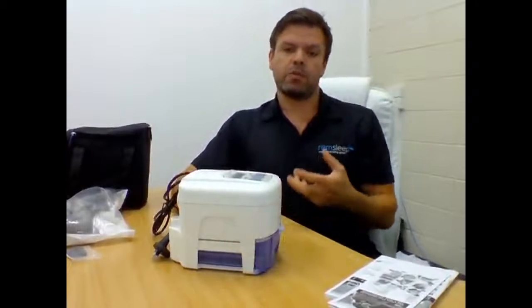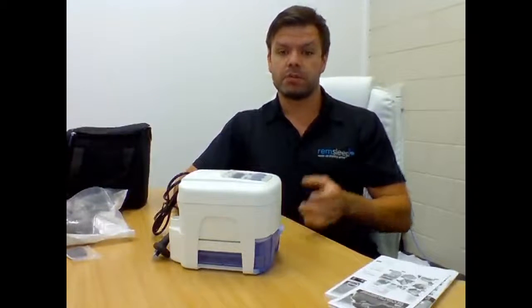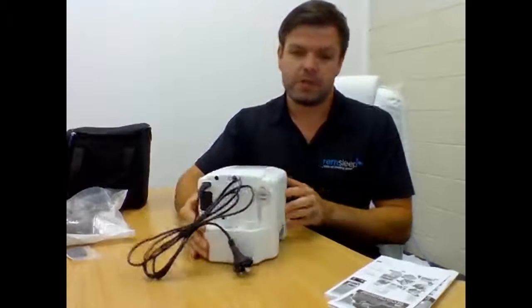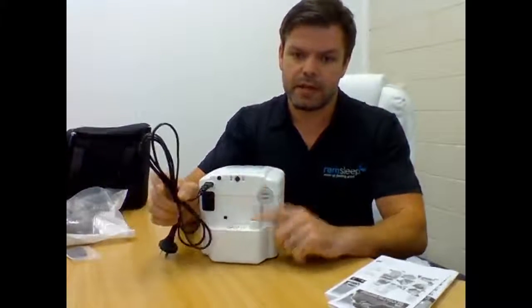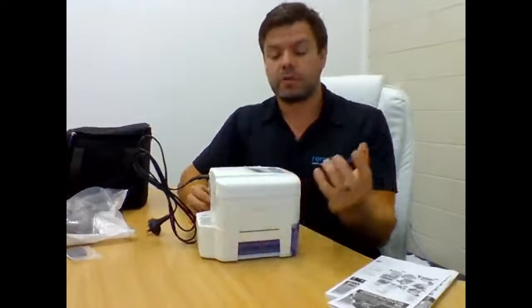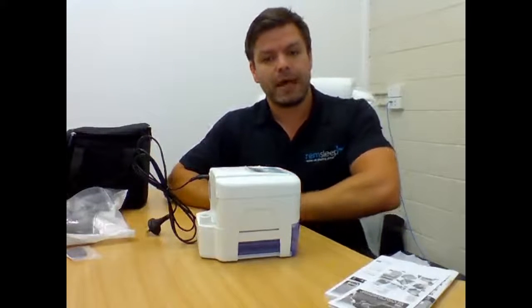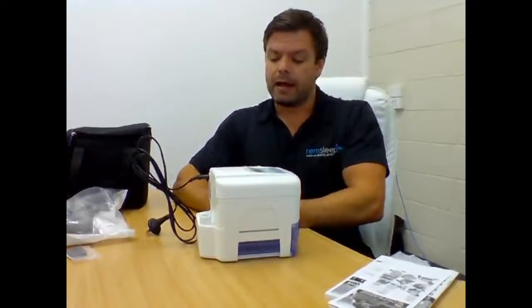So the machine's pretty much, once we've got the water in, set ready to go. You can plug it into your wall. It will come with the automatic on function set ready to go. So all you need to do is put your mask and tubing on. The tubing there connects to the back here, and the other end goes to your mask. Once you connect it up, you start breathing, the machine will turn on automatically, and then it will auto titrate the pressure throughout the night, depending on what's required to keep your breathing nice and open and stable to stop all that snoring and sleep apnea.